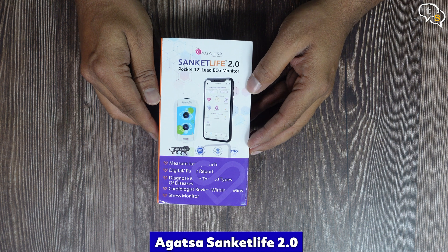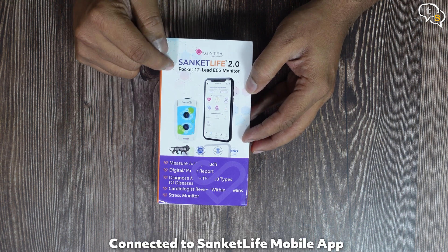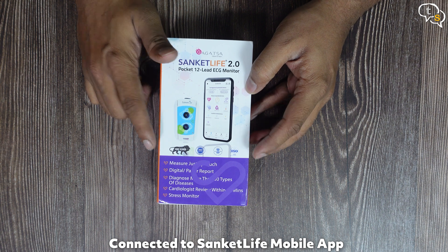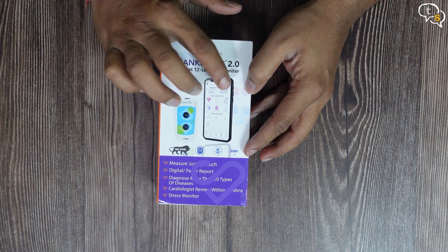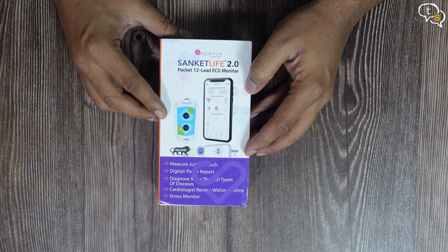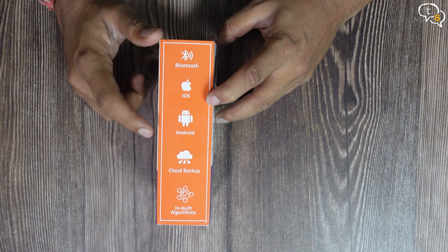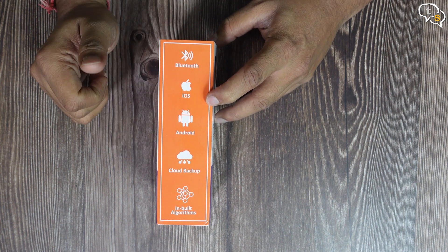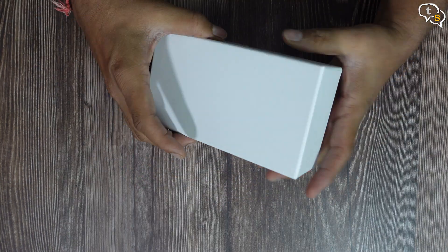This is the Agastah Sanket Life 2.0 Pocket ECG monitor. It's made in India and has an app to monitor and store the readings from the device. It works via Bluetooth and has apps for both iOS and Android. We have cloud backup, which is activated when you create an account. The inbuilt algorithm should take the input values and provide insights. Looks easy to use, let's unbox the device and set it up.